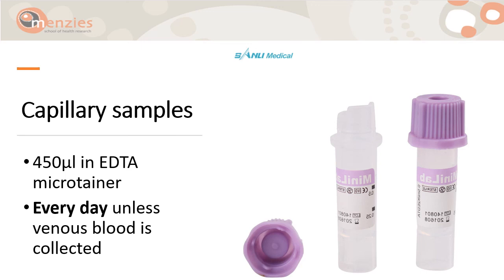Capillary samples are every day unless venous blood is collected. It's a maximum of 450 microliters in an EDTA microtainer, such as pictured here on the right.